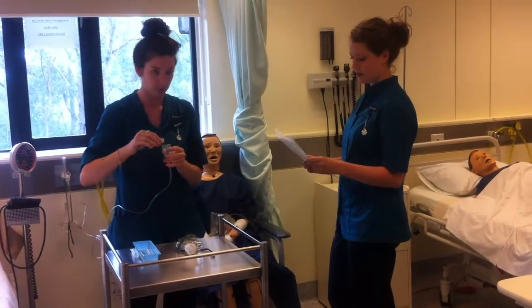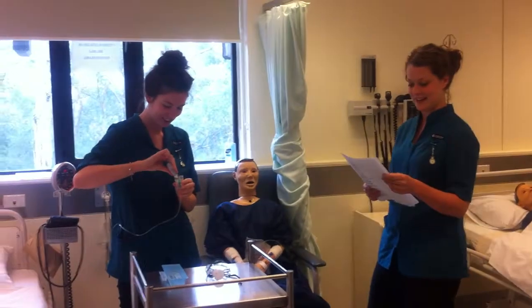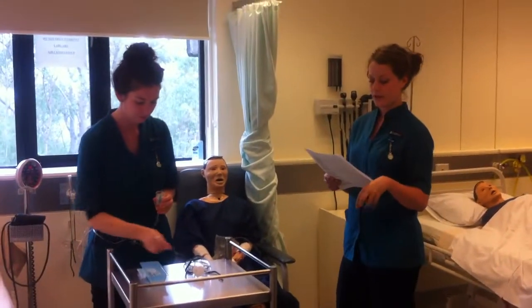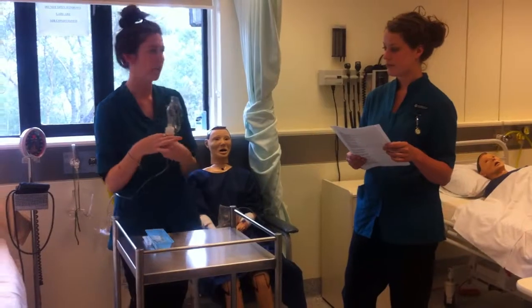And the drug against the prescription? Yeah, we did that earlier. Alright, so when placing the drug in the nebulizer chamber, a minimum of 2 mils and a maximum of 4.5 mils should be used. Alrighty, so that's all set and ready to go.